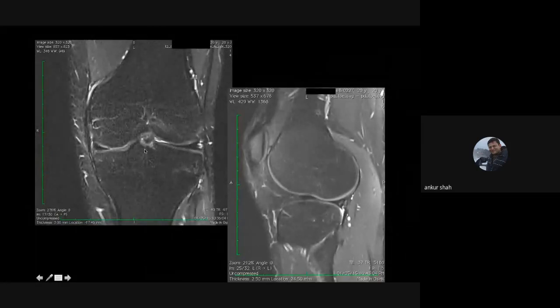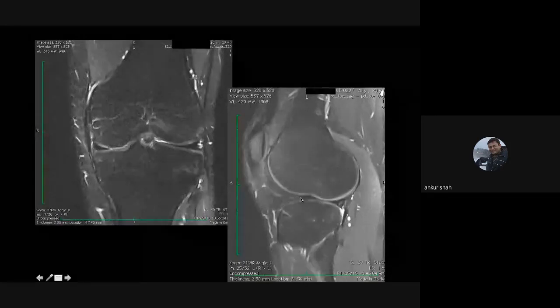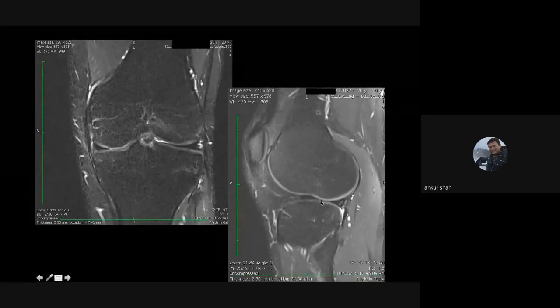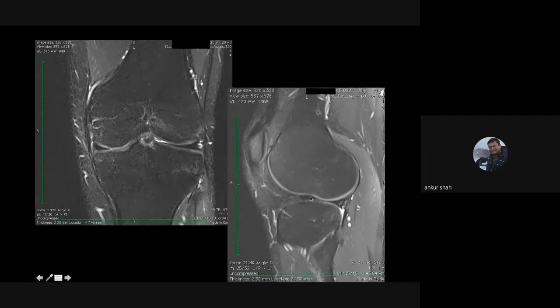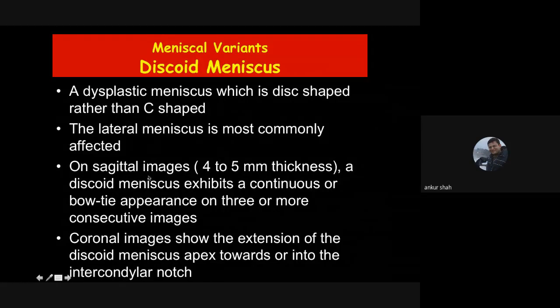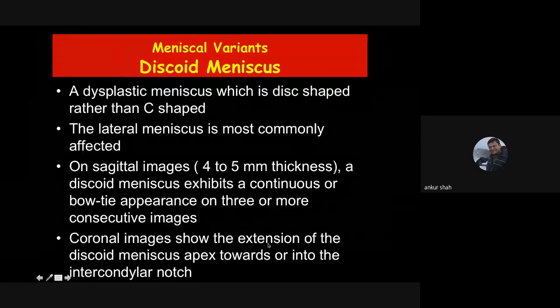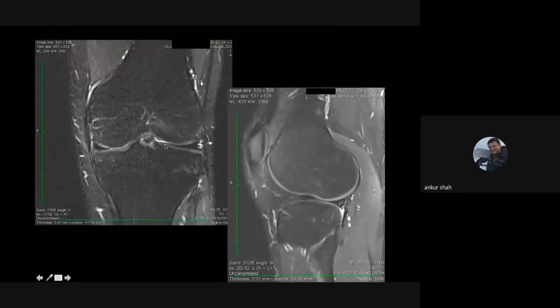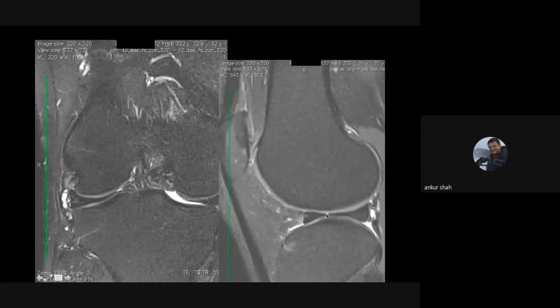If on sagittal images in the mid part you see continuous meniscal tissue throughout instead of just the anterior and posterior horn with a gap, this appearance is known as discoid meniscus — a dysplastic meniscus that instead of being C-shaped is disc-shaped. On coronal images you can see extension of the tip of the meniscus up to the intercondylar region, whereas normally it stops at the body part. Discoid menisci are thicker and more prone to injury, so almost always you will see a discoid meniscus with some kind of tear.